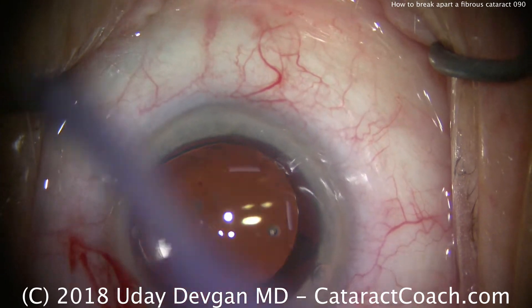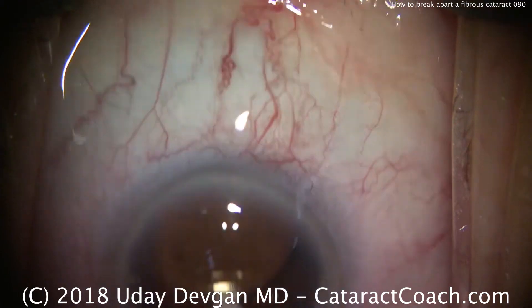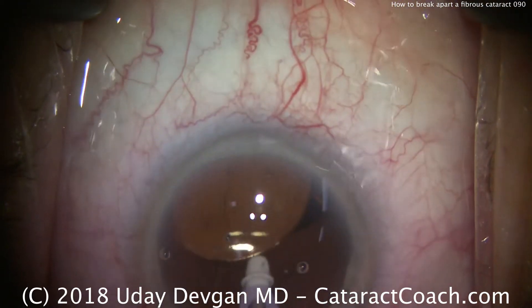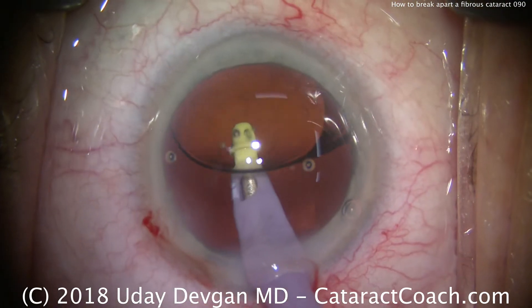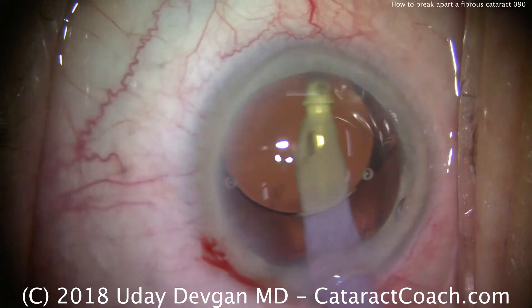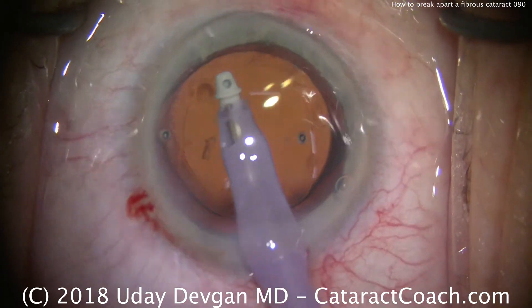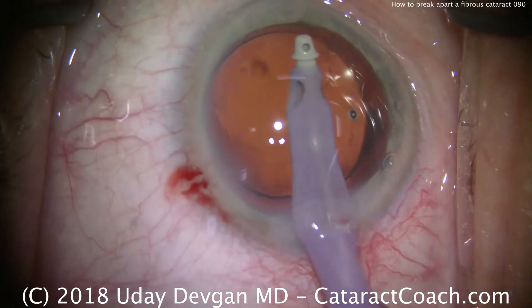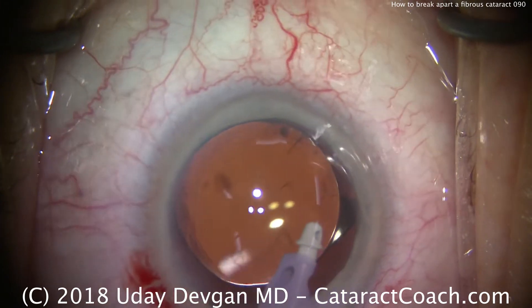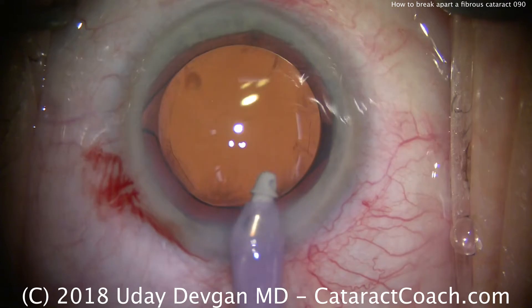Now going into the eye with the probe one more time, going underneath the IOL. Time to remove the viscoelastic from behind it. This being a cohesive viscoelastic, it should remove relatively easily. Then we'll remove the remainder of the dispersive viscoelastic in the front of the eye — for this you want high flow settings. It's that flow of fluid going through the eye that's going to help remove all that dispersive viscoelastic.